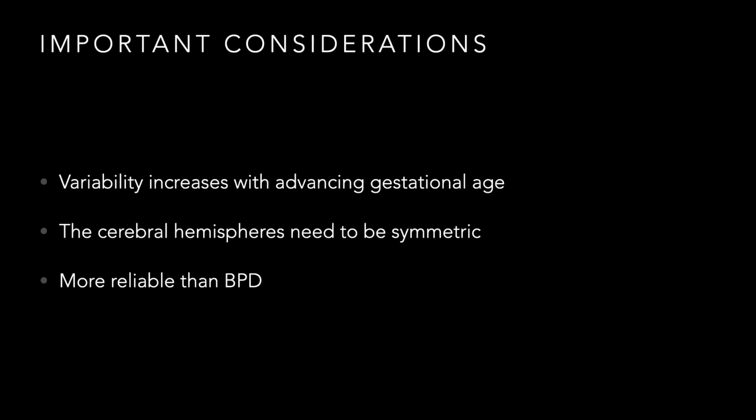Now, to add to that, one study that I read basically indicated that a combination, they came up with a mathematical formula between the biparietal diameter and the femur length, which we'll talk about next, was probably the most accurate way of assessing second and third trimester gestational age. Now, I don't routinely calculate that out, but just know that this is probably a little bit more accurate than biparietal diameter, and is something that you can use. And certainly in our practice, what I've done is done both, right, and see if they both roughly correlate with one another, and that's really, really helpful, right?